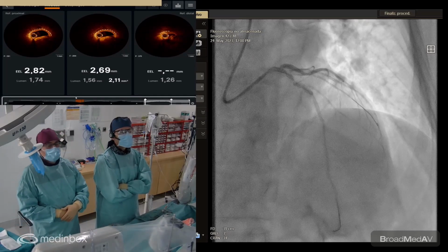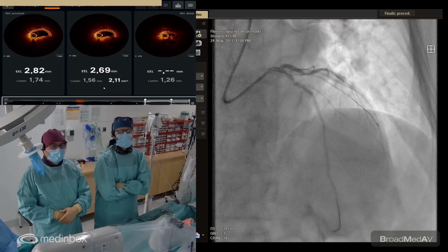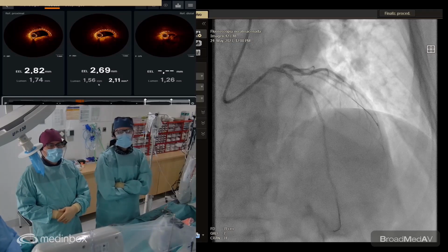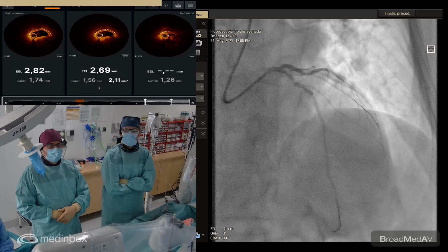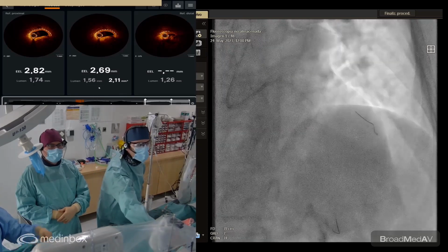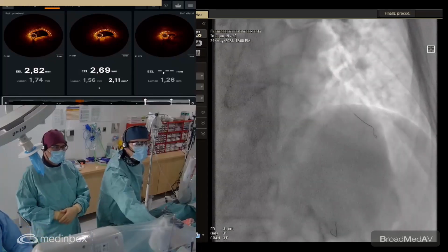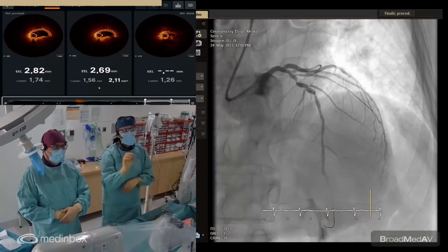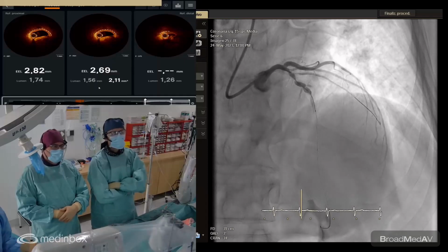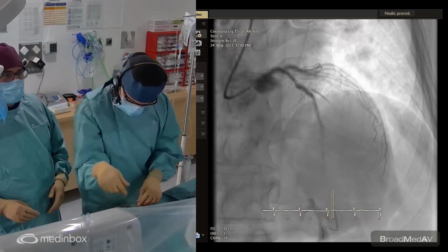Yeah, the problem of the OCT is that probably with this aneurysm and also the occlusive lesion with the catheter, the flow and the blood is still there and not washed. It has not been washed with the contrast, and the image is not perfect. We thought about the option of predilating a little bit before the OCT, and we tried to do it from the very beginning just to not be seeing the modification.